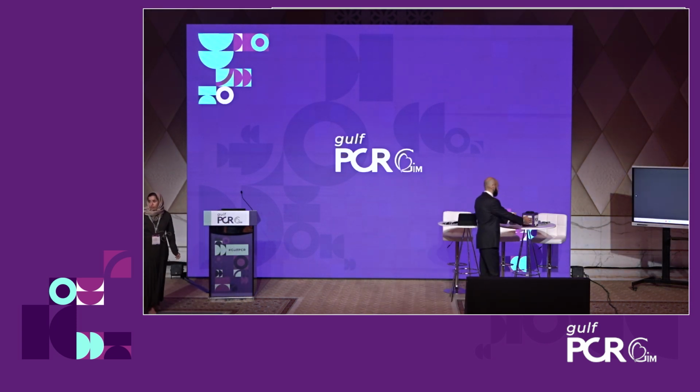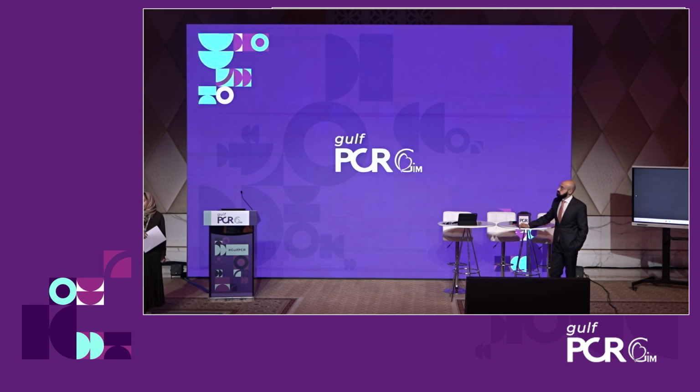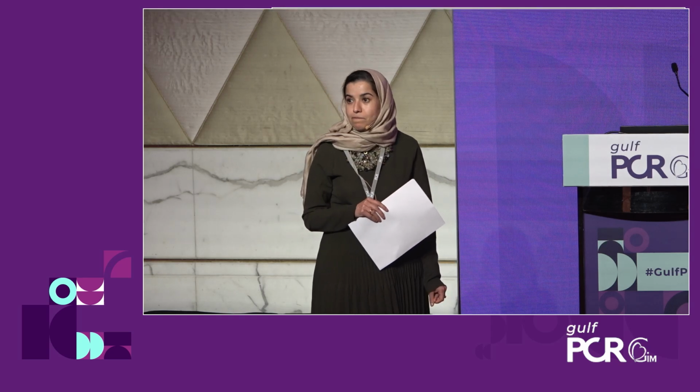So in your experience, Dr. Sayed, have you seen any quick valve degeneration with this device? You've had good experience with it? No, and I think the data of the IDE was totally unexpected and a bit disappointing as well. There are some limitations, as you mentioned, about the proper pre-dilatation. How was it achieved? The size of the balloon, post-dilatation if needed, and so on and so forth.